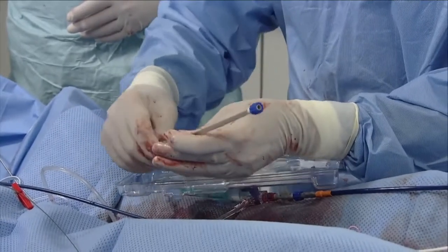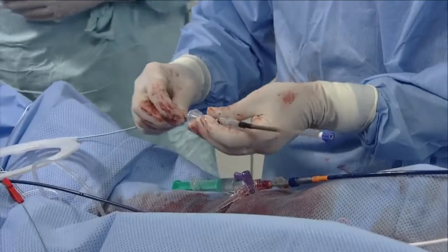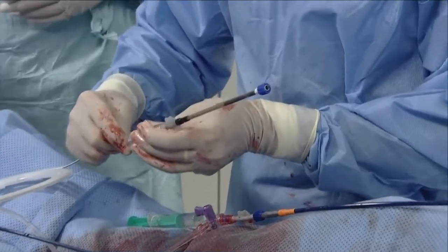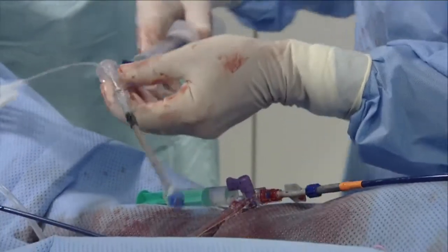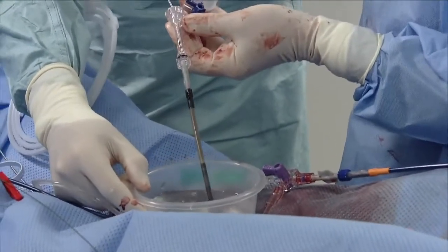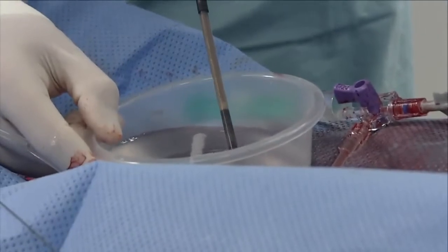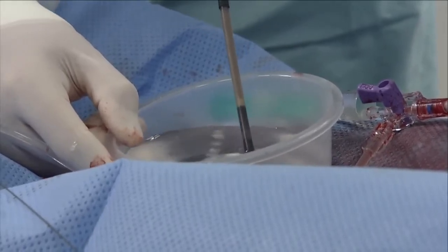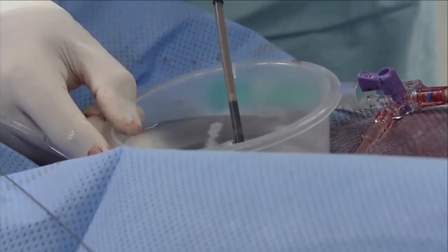So what will you do with the distal part of the sheath? Reposition it, or how would you do that? Let me check with Andrew. I think I'm still okay. I might have been tempted, as you just had one go with that 25, to try a slightly different sheath angle and deployment. Eric is nodding, so he agrees with me. I didn't know what to do differently because I was in the anterior lobe. I pulled back until it jumped above this. But the orientation of the device, in the short axis at least, didn't look quite right, and I just wondered if you might have been able to influence that.